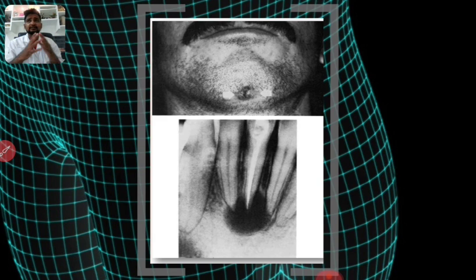The canine was really long, and the root of the canine was a little buccal. On top of it, she had a 4-4 bridge. I don't know why, but she had a 4-4 ceramic bridge, and I was quite sure that because the canine has the longest root, that's why this sinus was draining extraorally. I simply drilled a hole in the bridge in the canine and removed the guttapercha. It was already treated.